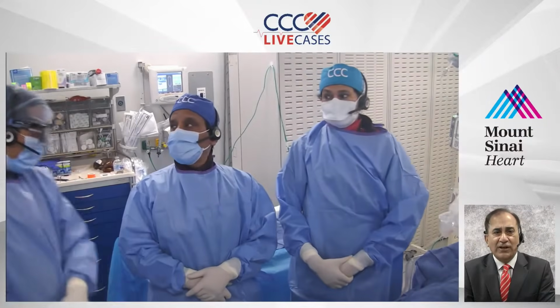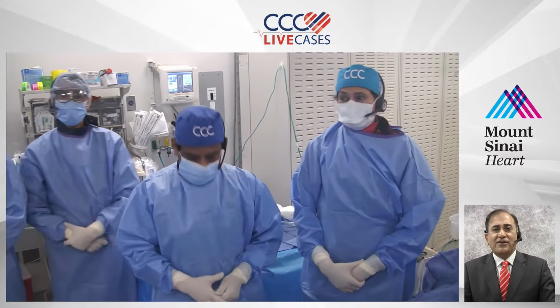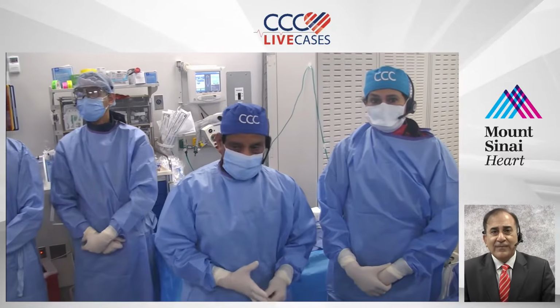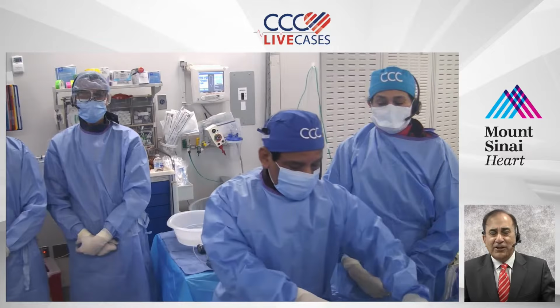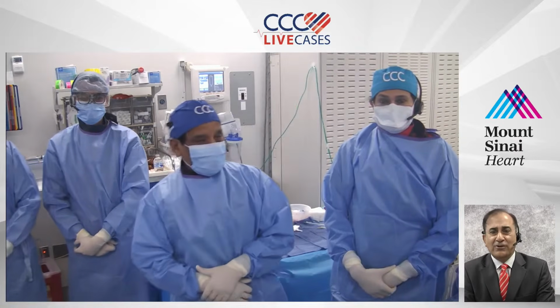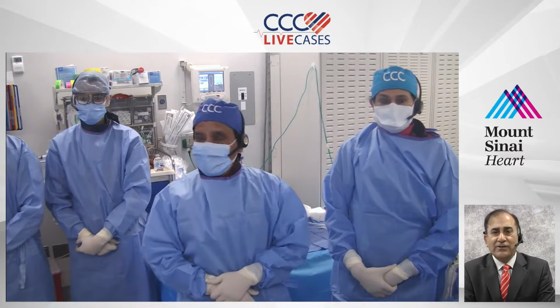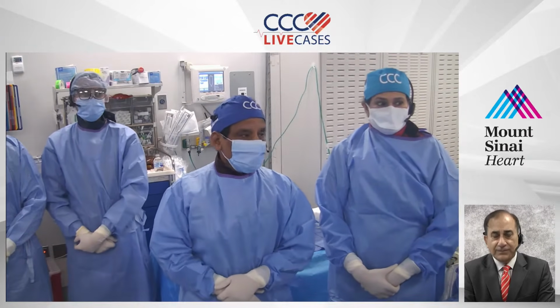With that introduction, let me take you to the Cardiac Cath lab where Dr. Sharma and Dr. Kinney are standing by. Sameen, good morning. Anu, good morning. More and more people are talking about your apps. Good morning. Unbelievable job with that. Each new app is bringing more, and hopefully they'll be able to use the CTO app today too. Yeah, so new wires are going to be shown in there.